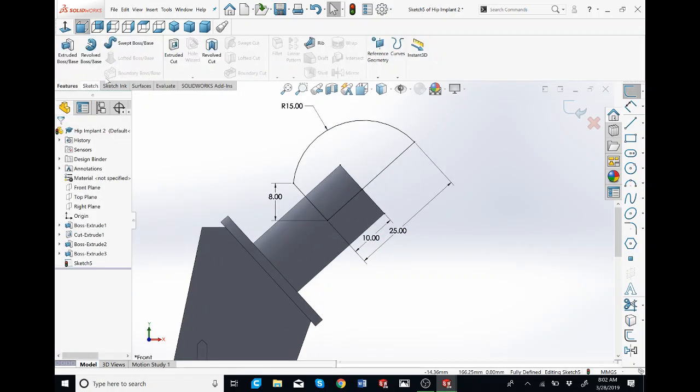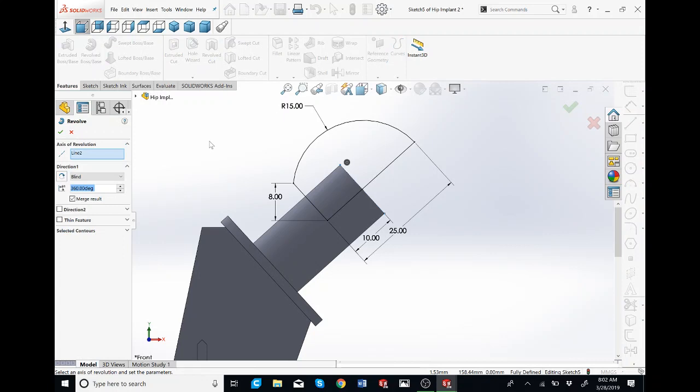So in the features tab, there's this revolve function. And what this does is it actually makes basically a circle. So you can see I have a line 2 selected, which is this line. That's not the line I want. So I'm going to right click, hit delete, and I'm going to click on this line.